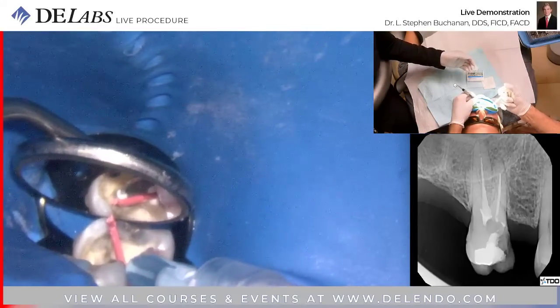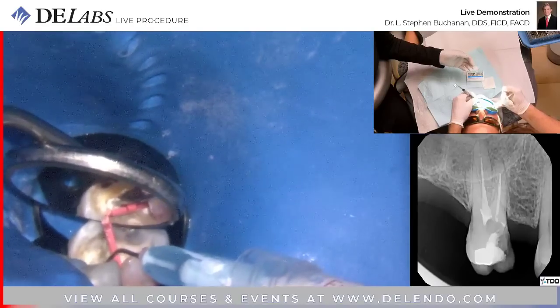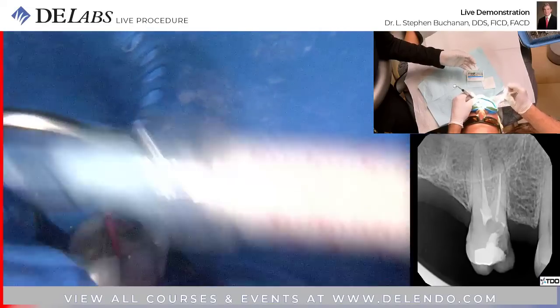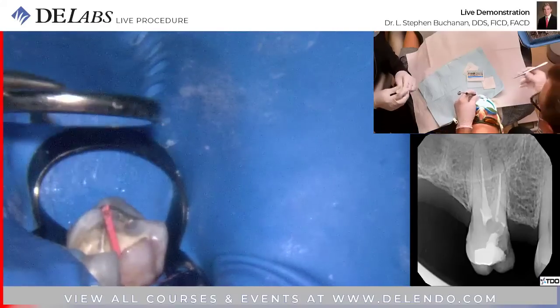You can see the needle is smaller than the canal. That's the key factor here. I think this needle uses a little bit less gutta percha to fill the lumen also than that plastic.